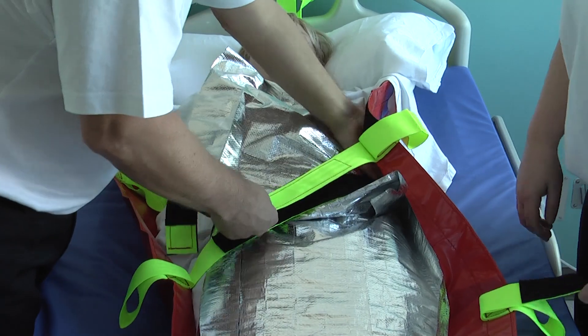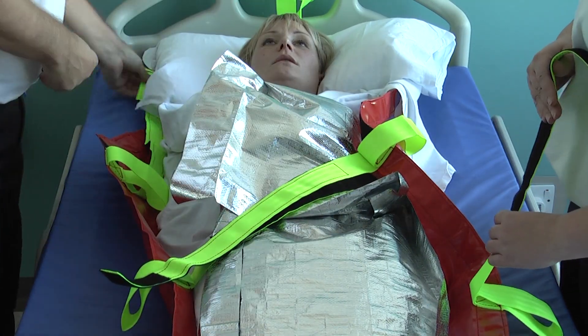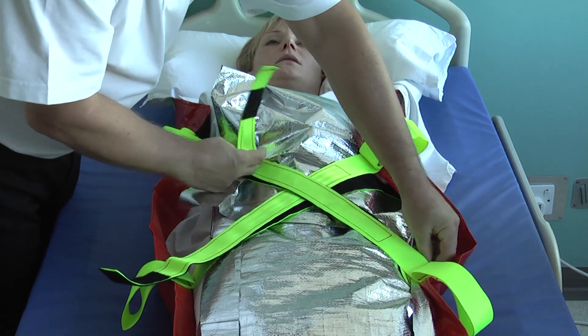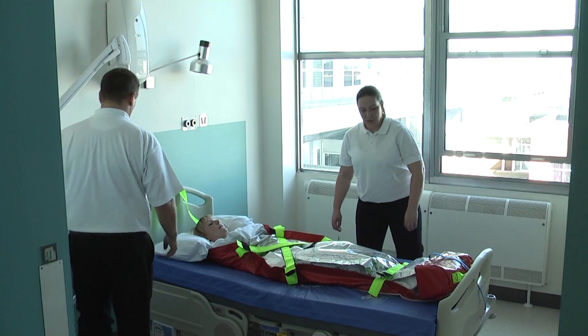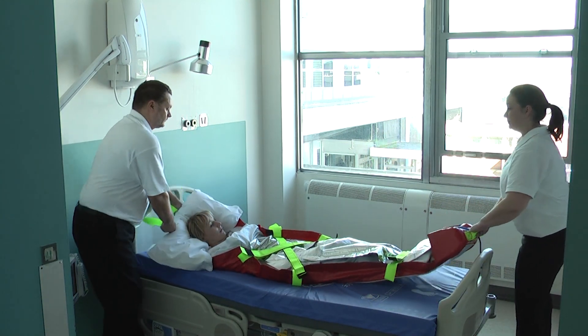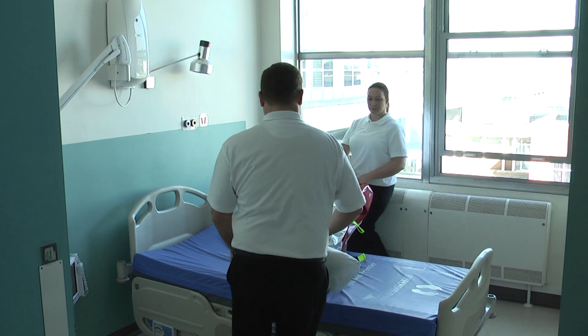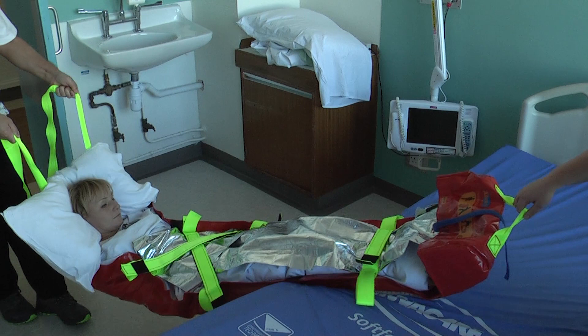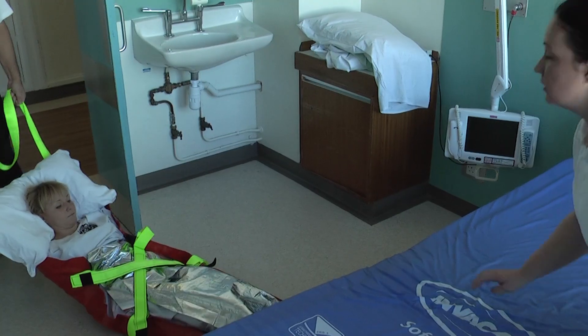Various methods of taking the user off the bed can be used. Please consult your moving and handling department to ascertain the correct method of transfer for your own specific environment. With a person at each end of the ALBAC mat, take hold of the end straps and move the user into a position where they are lying at approximately 90 degrees across the bed ready to be taken off. The person at the head end keeps the strap short and starts to move backwards slowly, allowing the ALBAC mat to touch the floor. The foot end operator helps to control the descent of the ALBAC mat onto the floor using the foot end strap.